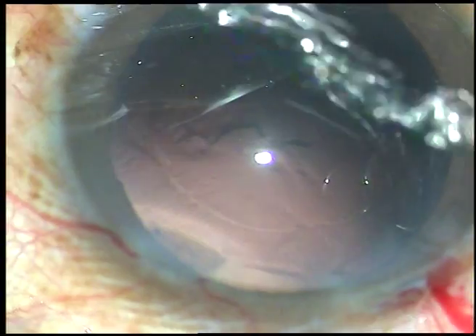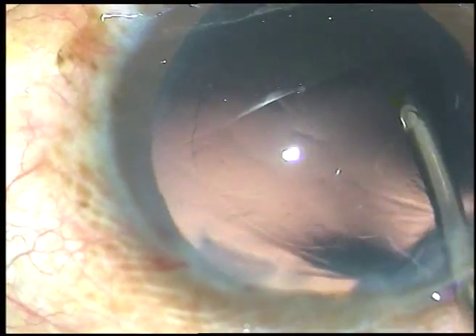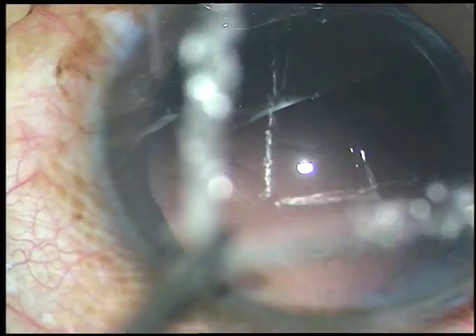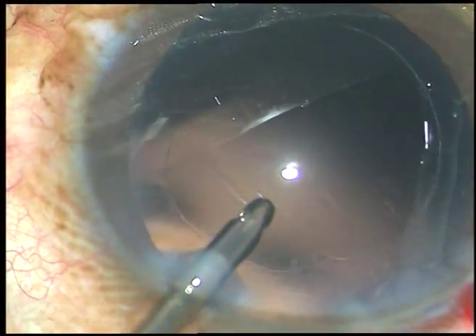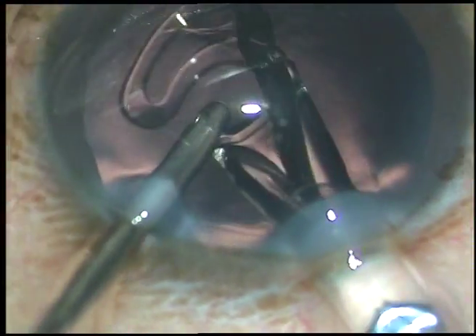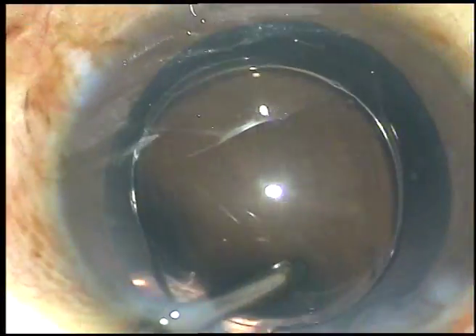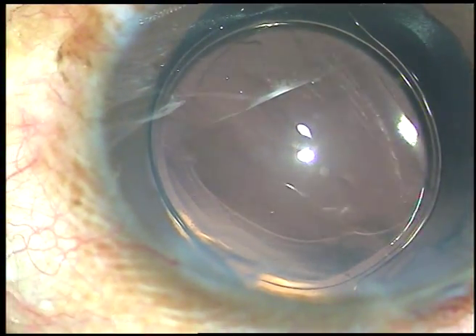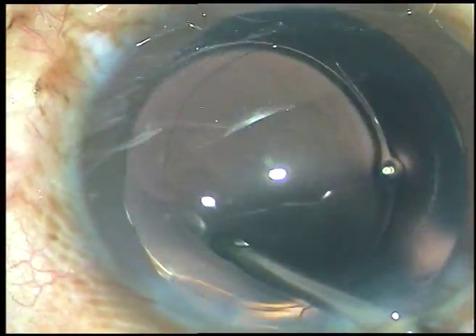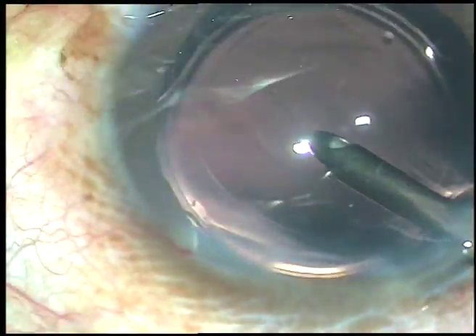Now an intraocular lens is to be placed. A little bit of polishing of the posterior capsule is being done. Now the lens is being placed under irrigation. Here goes the intraocular lens. The optic is supported by the irrigating probe and the irrigating probe places the trailing haptic in the capsular bag. Now the lens is dialed with the irrigating probe.